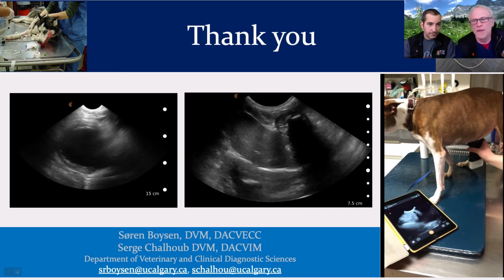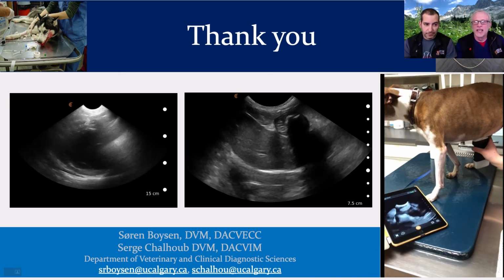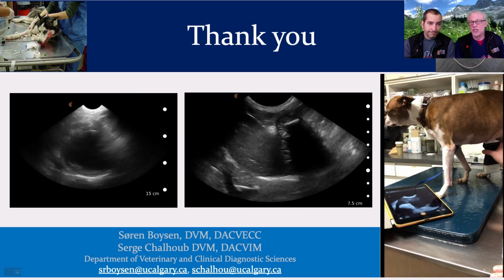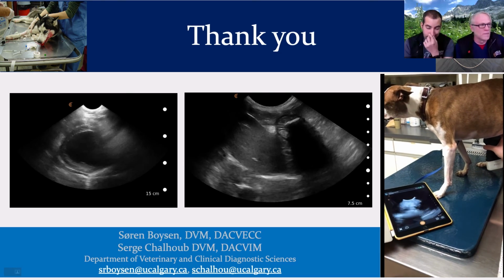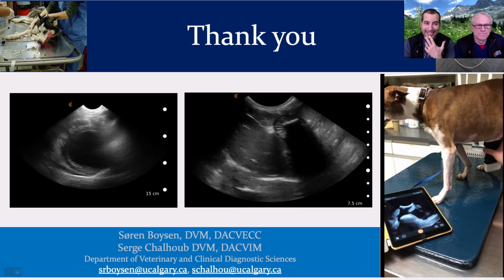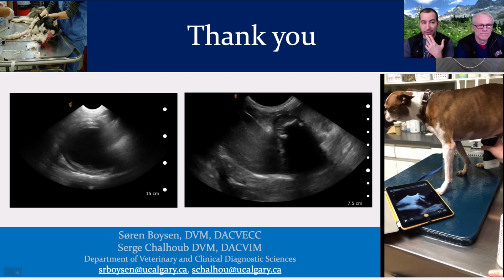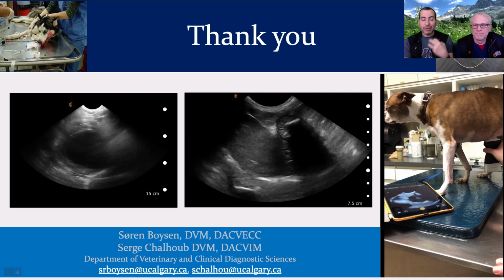A million things we can pick up in a matter of seconds, all under 5 minutes, simply by reaching out, putting the probe on like you see, and having an iPad or an iPhone available to assess what we're looking at. It's truly amazing what we can do. In case you're wondering, that dog has DCM. That's why we're looking at that heart's contractility. This is a short axis mushroom view. And this is, again, something you can do with point-of-care ultrasound.